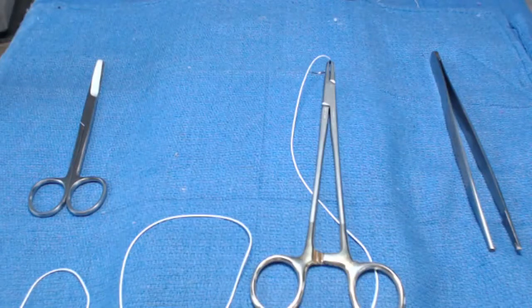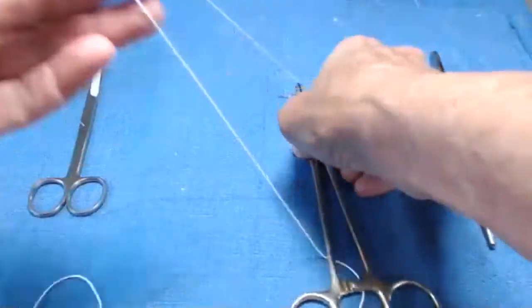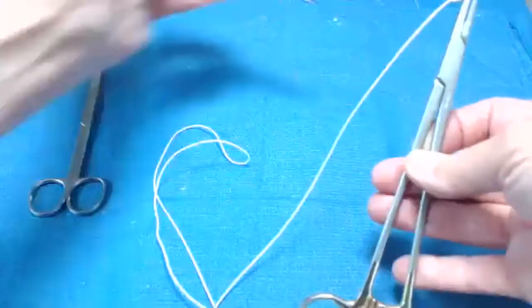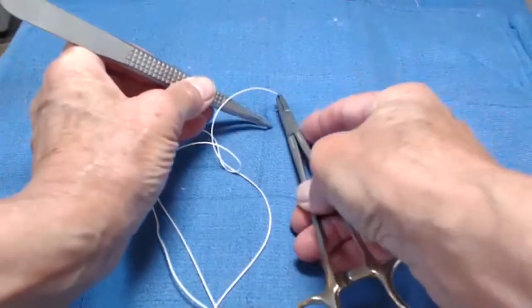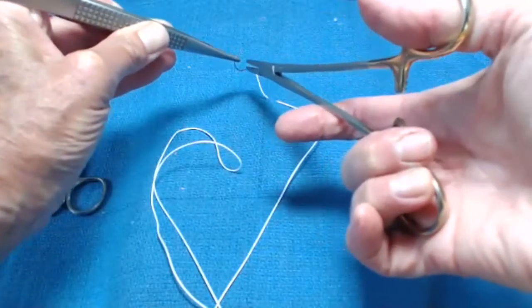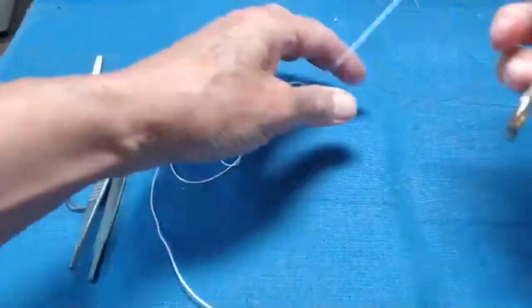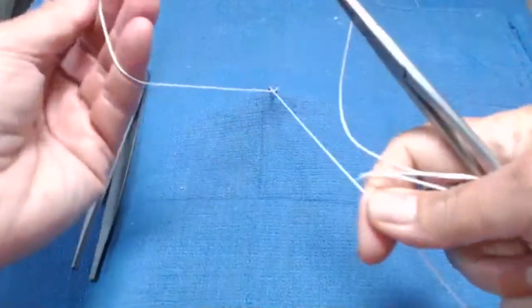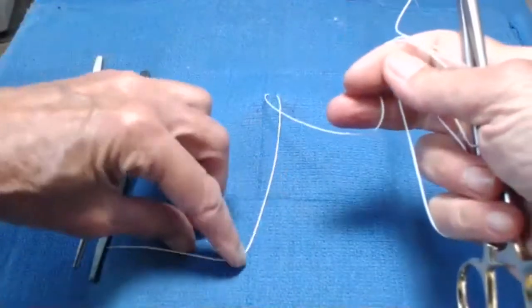So we're going to move to the work screen, and I will do a little demo for you. I'm using a bright white Gore-Tex suture, so not something we would typically use for perineal repair, but I wanted to have something that was clearly visible. I'm just going to take a little stitch in here. I am not going to protect my needle, for the simple reason that I am not putting my needle holder down at all. I'm going to be pulling my suture through until I have it just right.